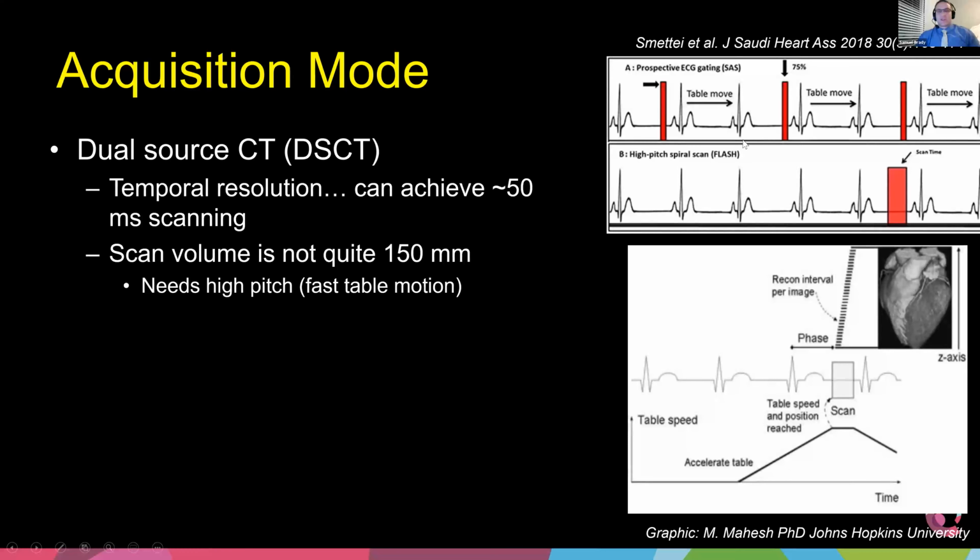In a traditional case, if you have this diastolic region right here that we're going to acquire all of our images in, to collect all the data in that part, you might have to pass over it 2 or 3 times as you collect multiple helical runs. So the heart is there, the body's moving, it's going to acquire, acquire, acquire. And then once you've collected all that data in that phase of the diastole, you're good. The exam is done.